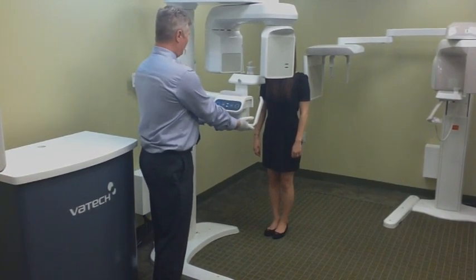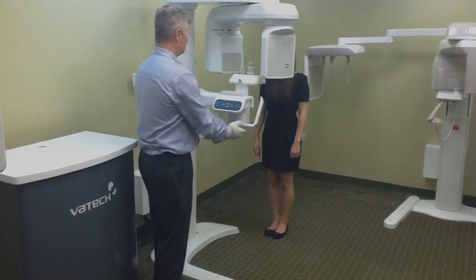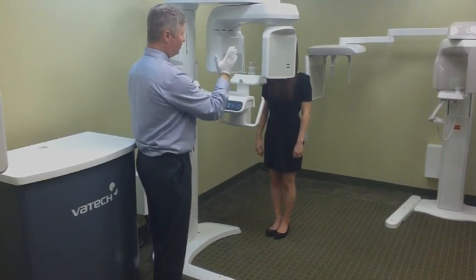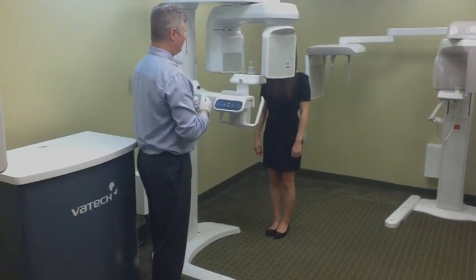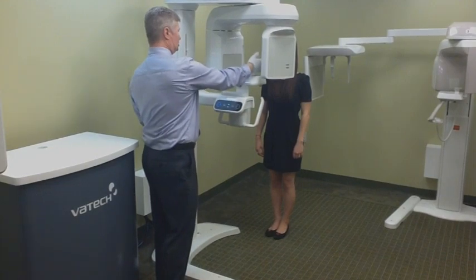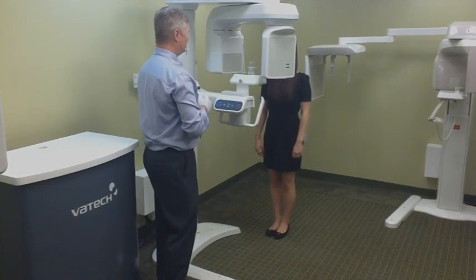I'm going to identify where you want your hands to be, with your palms facing up towards the ceiling and the bottom of the bar. I'm going to have your feet come into the device and place about an inch forward or vertical, still remaining a good posture as far as staying in a vertical orientation. And then lastly, put your chin on the chin rest here with your bite on the bite stick itself.